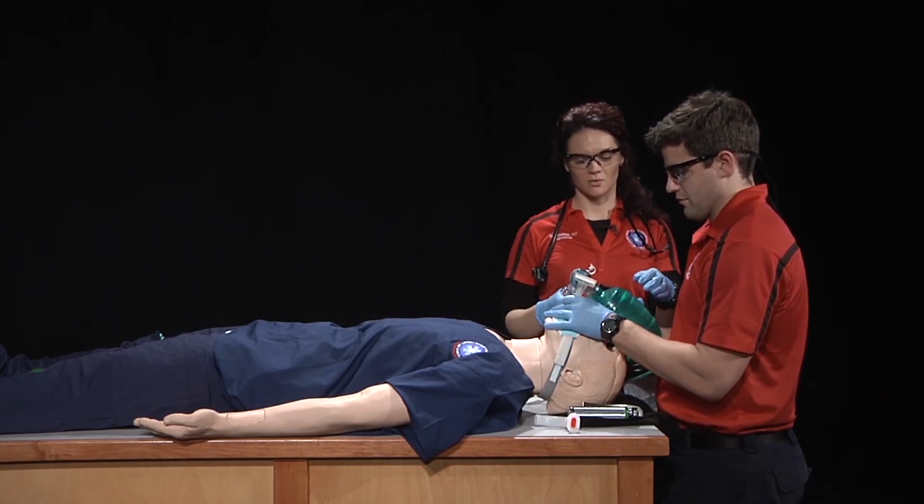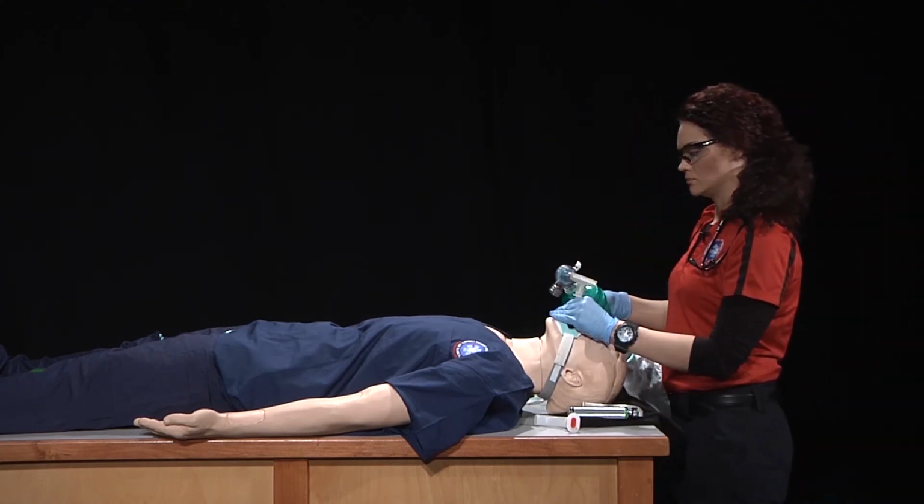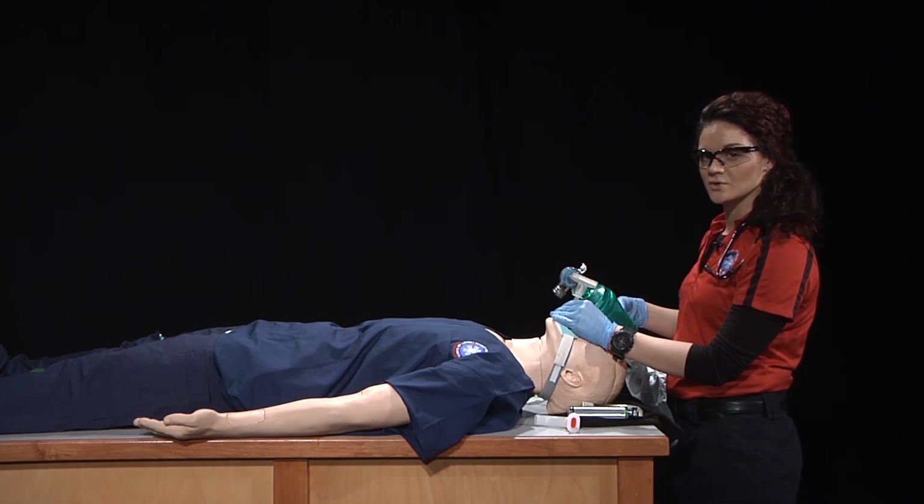After the tube is secure, I'll resume ventilations and continue to monitor my patient's capnography and SpO2 readings.